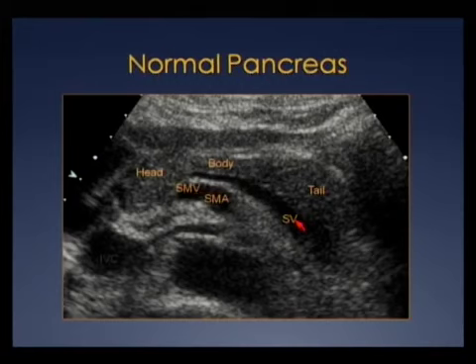And again, knowing your vascular landmarks is actually critical to sometimes assessing a midline abdominal pathology that is either expected or unexpected by ultrasound.